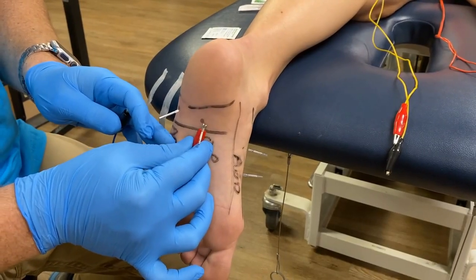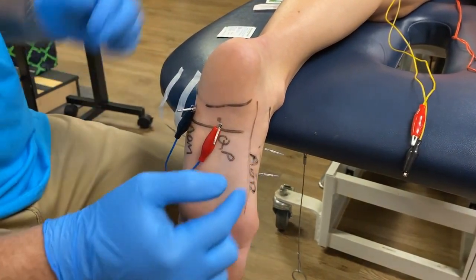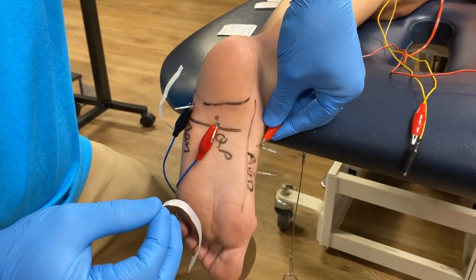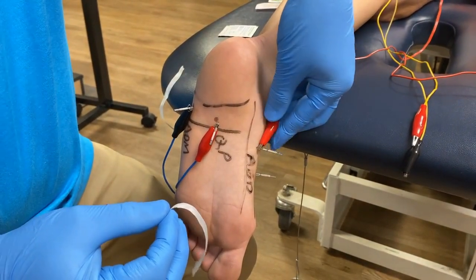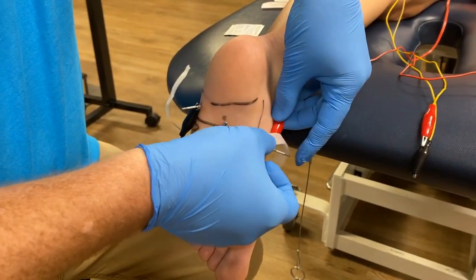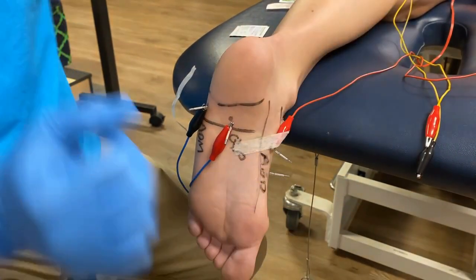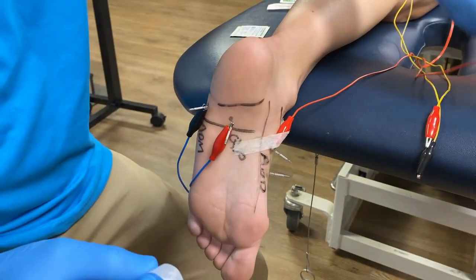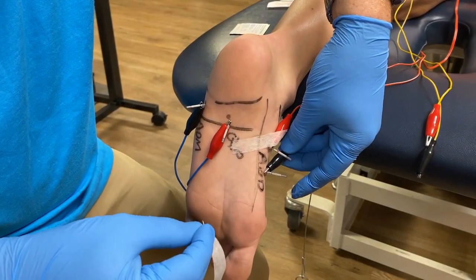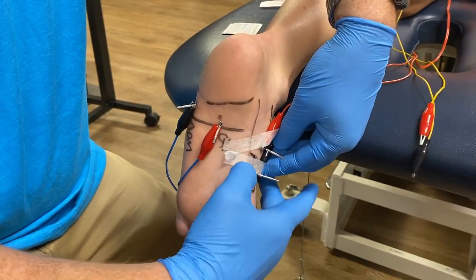The quadratus plantae and abductor digiti minimi needles are in a position where you usually don't have to tape the electrode down. However, the abductor hallucis needle, due to its angle and because it's only a 15-millimeter superficial needle, often requires a small piece of tape. I like to use half-inch micropore tape — anything more than half inch gets in the way. Tape the electrode close to the base of the needle; taping it too far away will act as a fulcrum and pull the electrode out.